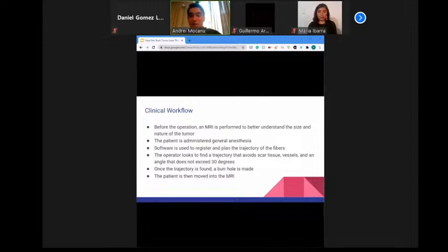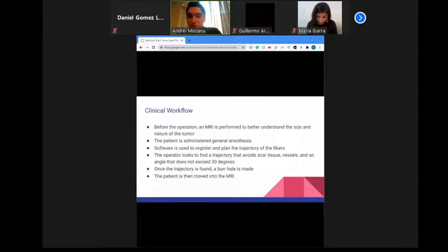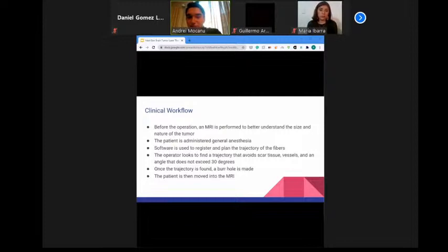A burr hole is made at the entry site and a stereotactic bolt is placed in the calvarium for one trajectory, or two bolts for two trajectories if the tumor is large. The patient is positioned within the intraoperative MRI and the laser probe is advanced until it reaches the center of the lesion. Before starting ablation, pretreatment 3D T1-weighted fast spoiled gradient images are obtained to show the full length of the probe and ensure accurate positioning. A T1 or T2 FLAIR image is then acquired as an anatomical reference image to overlay the real-time images on the workstation.